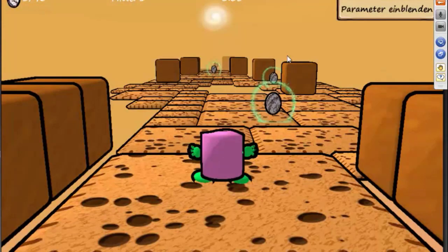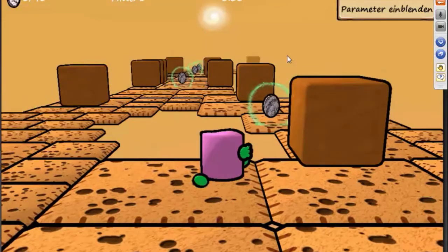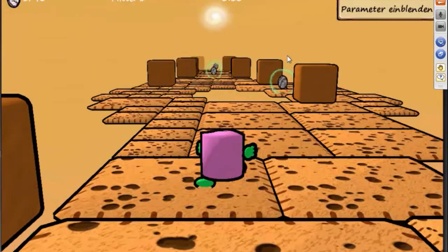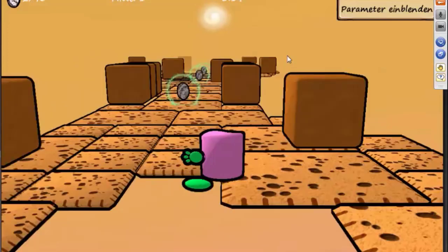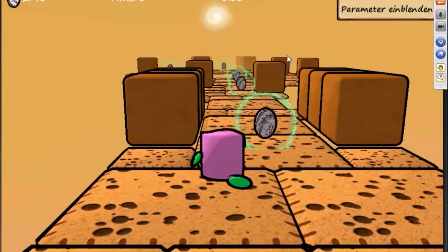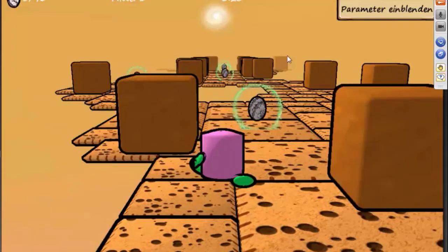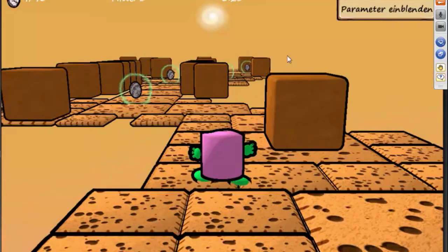It's a running game. You lean forward and try to collect the little chocolate bits that are on the course. You can either lean forward, left, or right. You try to avoid the obstacles, and you also try not to fall off the cliff. If you miss the chocolate pieces, you will not collect a corresponding point.